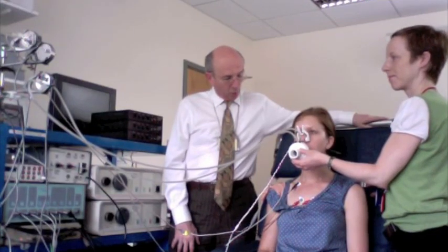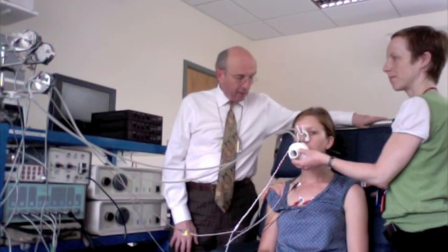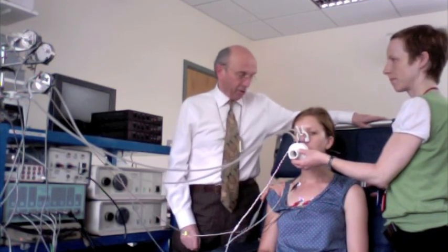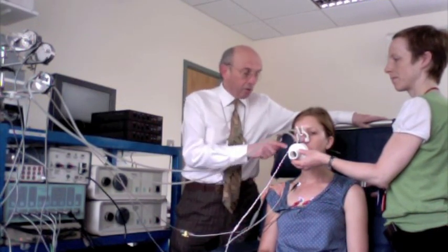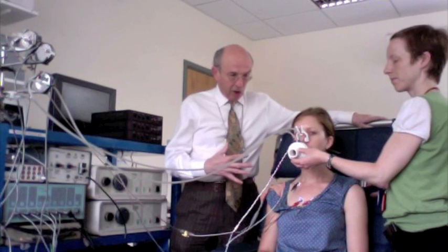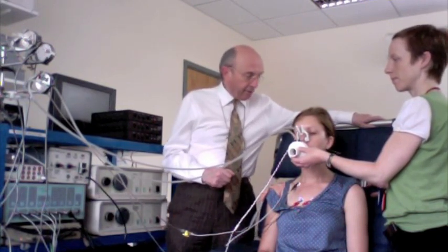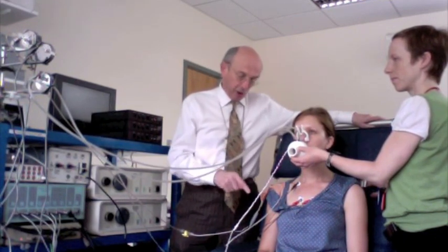So, what we're going to do this morning is look at the EMG of the parasternal muscles up here at the top of the chest, and also the EMG of the diaphragm, which we're going to record from this esophageal EMG catheter. And we're going to look at that measure of neural respiratory drive during quiet breathing.